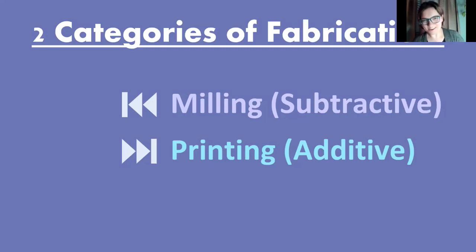If that sounds familiar to you, it is the same thing we were using in 1937 to make dentures. So that material that we've been using is actually the same material that we use in subtractive manufacturing or milled dentures. And we'll talk about that in just a few slides. I always say that when you mill a denture, it's kind of like Michelangelo chiseling David out of marble, except more beautiful because we are chiseling a denture out of polymethyl methacrylate.